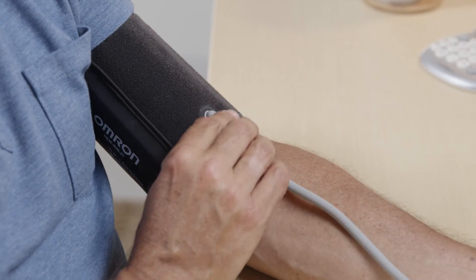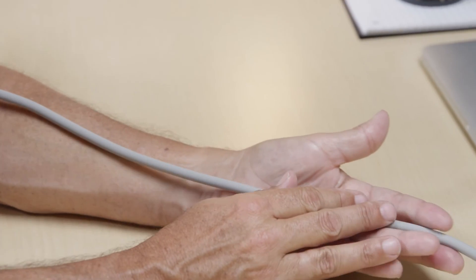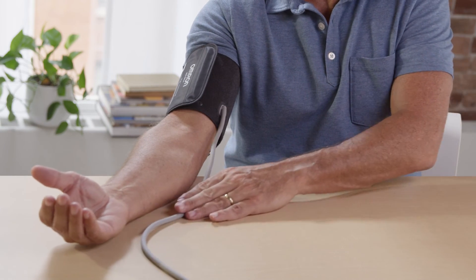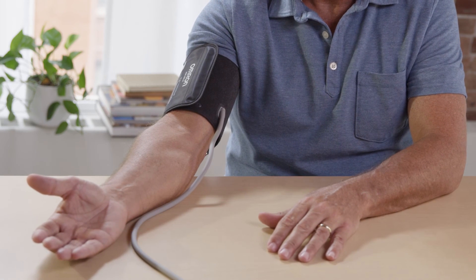If you are using your left arm, the air tube should run along the center of the inside of your arm and align with the middle finger. If you are using your right arm, the air tube should run along your elbow. Do not rest your arm on the air tube as it will restrict air flow.